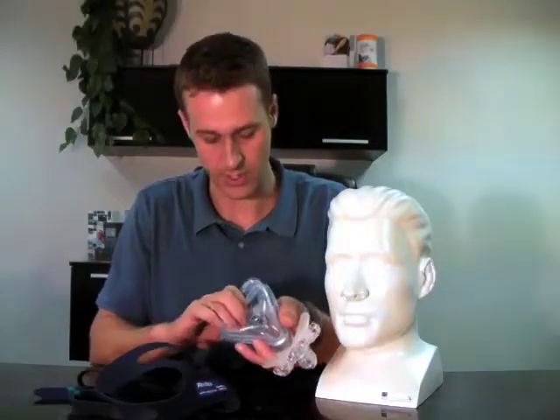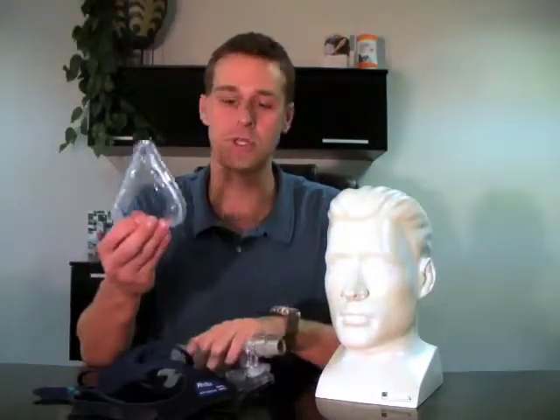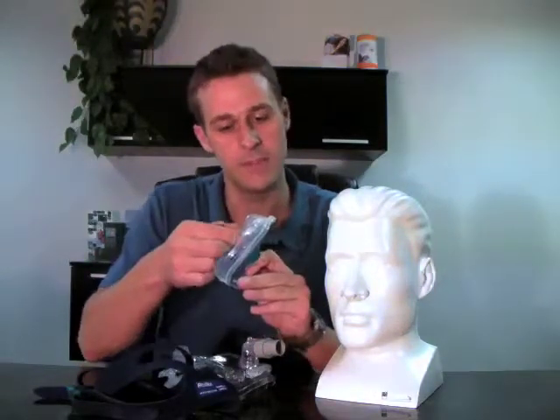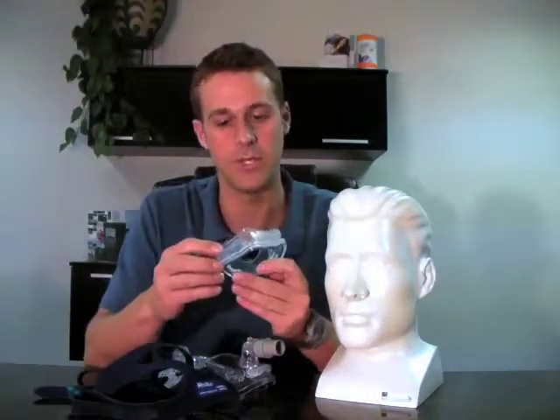The second piece that we want to talk about is the cushion. The cushion is the most common piece of a mask that will experience breakdown. This is made of silicone, and typically your insurance company would replace this about every month.